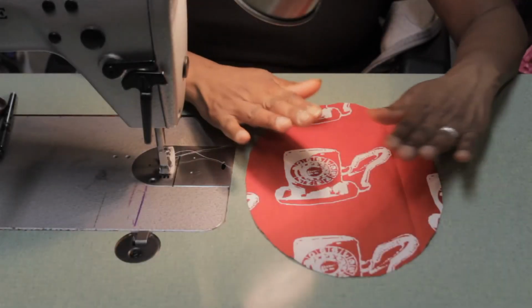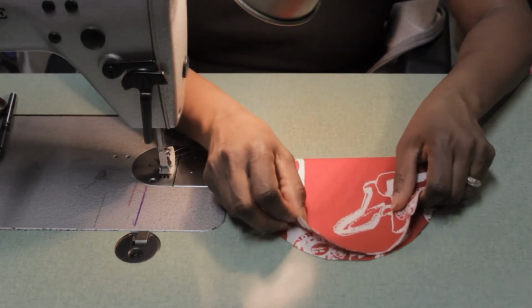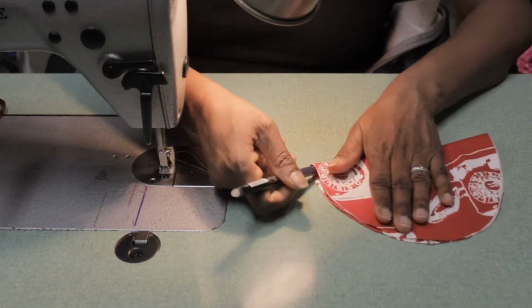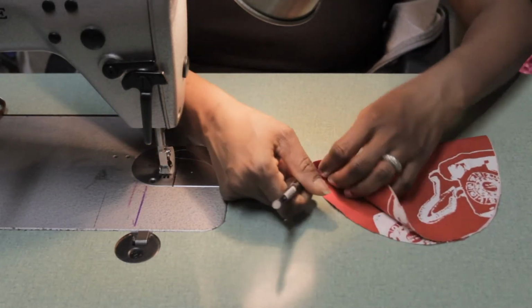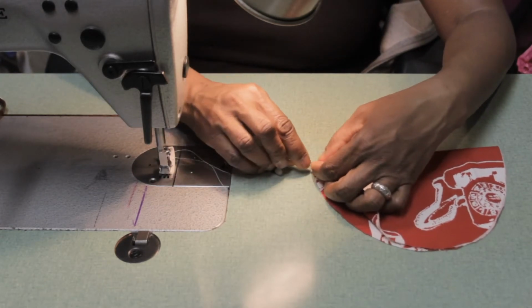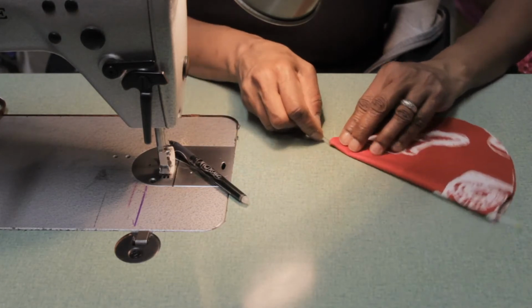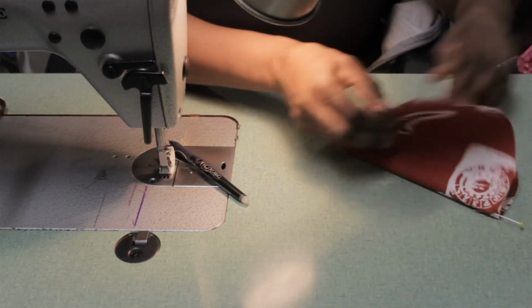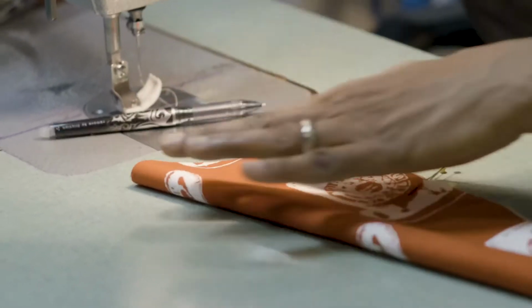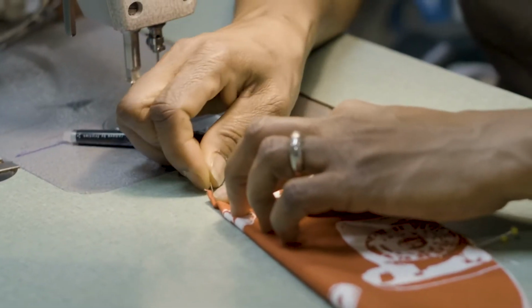Alright, next we're going to take this, the top of the scrub cap, and we're going to fold it in quarters. So we're folding it here, and I'm going to make a line. However you want to do it, you can do it with pins. Actually, let's do it with pins. So I'm going to pin my quarters. So fold it that way first, put a pin, and then I'm going to fold it this way and put my pins in. So now I have this divided into 4.